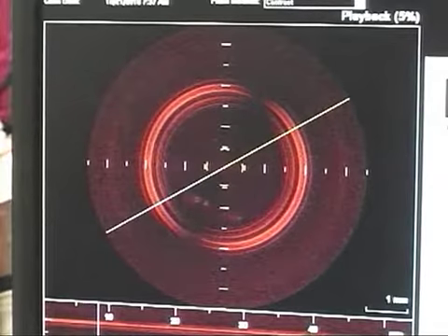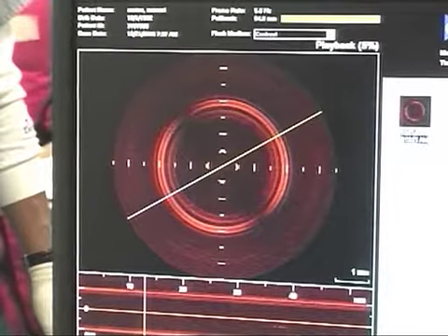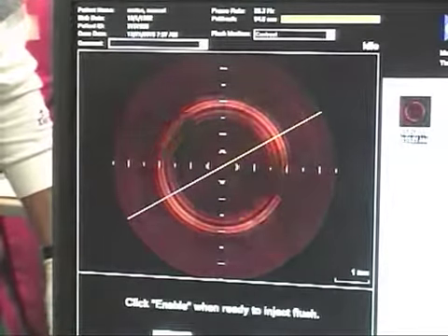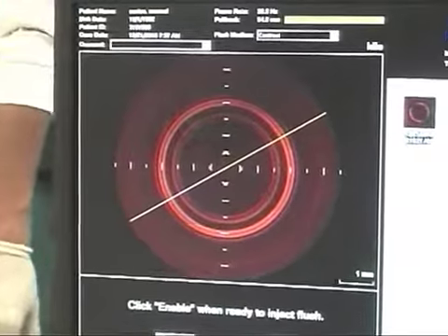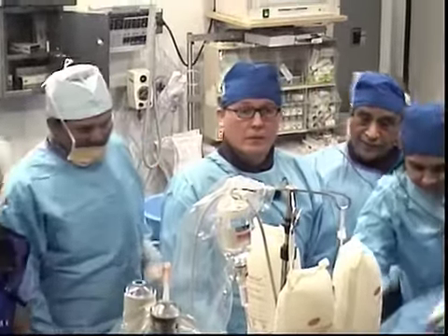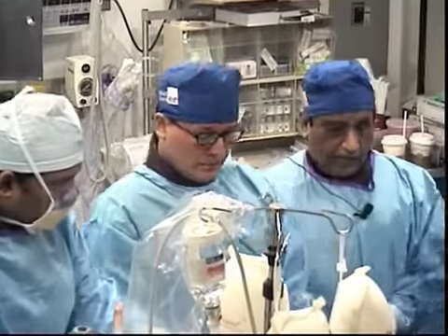This happens with the new technology, and I will now hand over to Pedro Moreno, who is, of course, expert in all the imaging modalities, including vulnerable plaque. Pedro, give us a brief outline of what OCT is, because there are a lot of questions. Are we going to use OCT in the future? Are we going to use IVUS in the future? What is good? What is bad? Just give us a quick brief review on this.